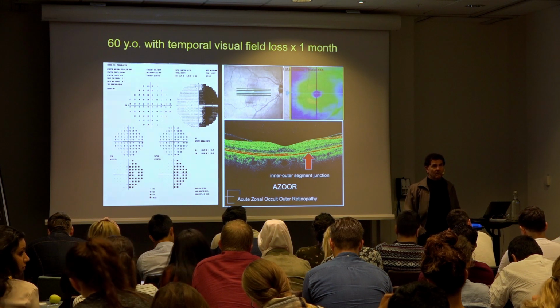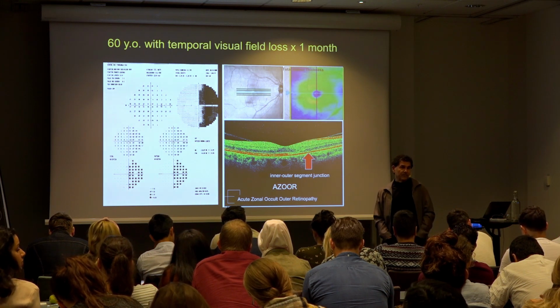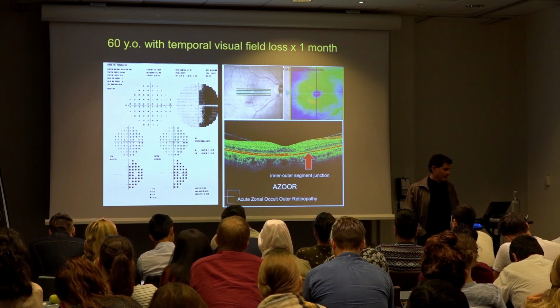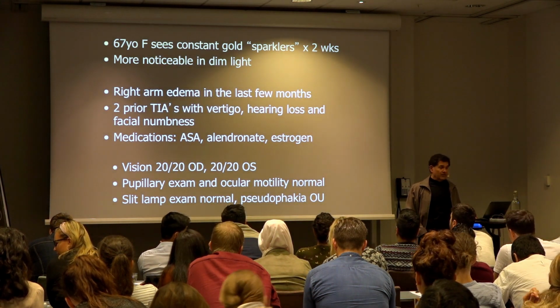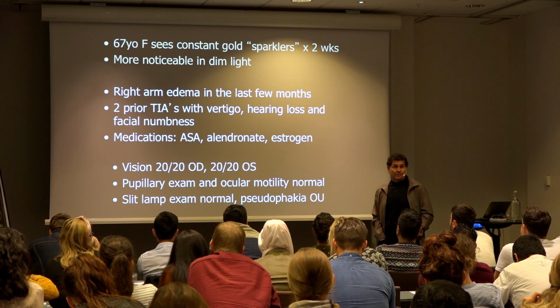I think the other eye is normal in this case. Yes, it was. What was the fundus image in this case? So the fundus image was normal.